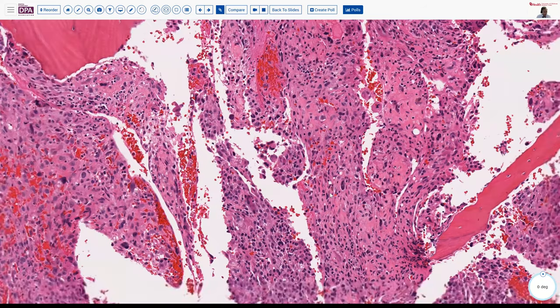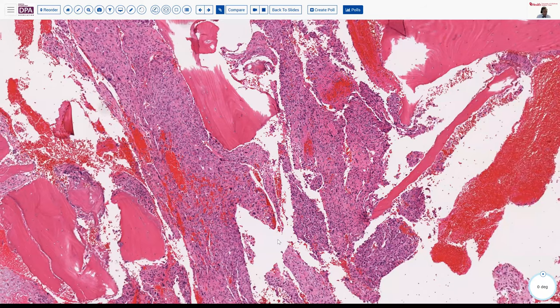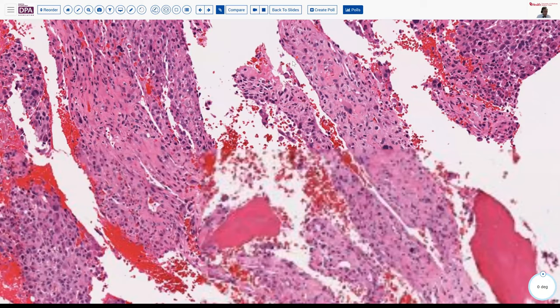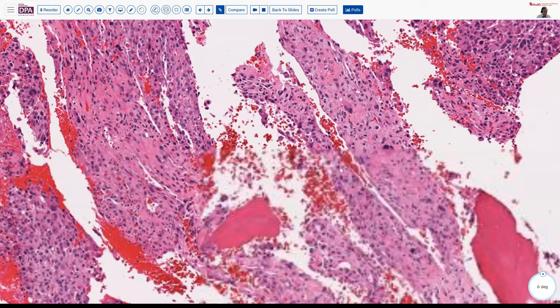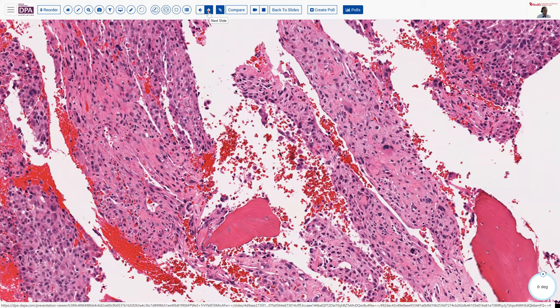Now it's called telangiectatic because it's very hemorrhagic. The amount of osteoid is fairly sparse and it tends to have these large blood-filled spaces or telangiectasias that form a part of the mass. And so finding these long, thin channels of blood-filled space would be supportive of that diagnosis of telangiectatic osteosarcoma. So that was presented as two sort of bone-forming tumor contrasts to our osteoid osteoma and our osteoblastoma case.